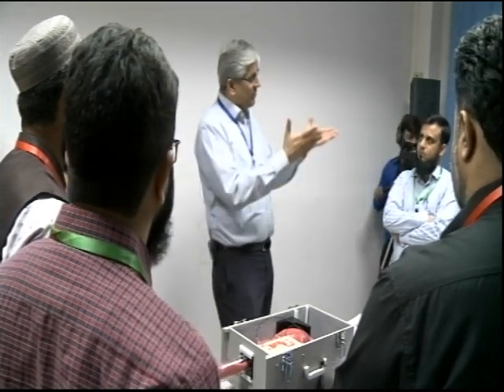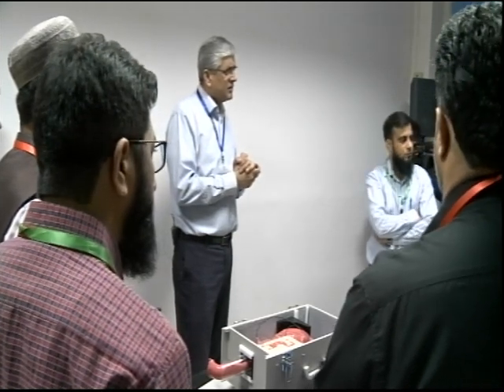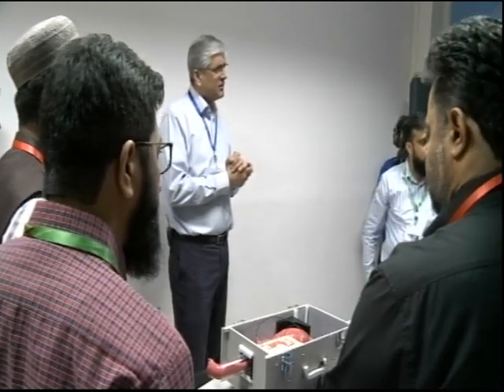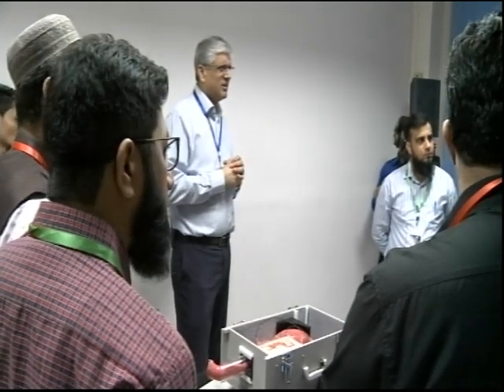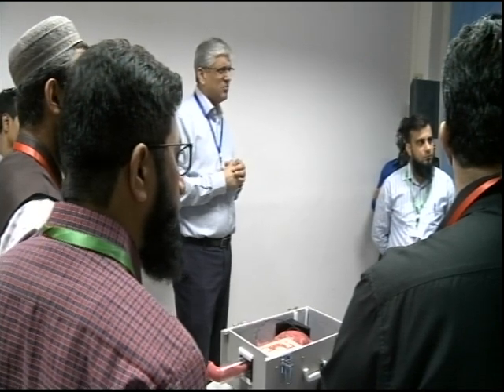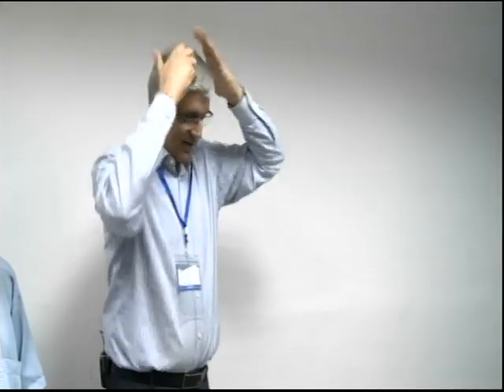Okay. That's one of the times. We have a bit of an incline, a little bump under them, so they're not completely prone. Okay, so slightly. The same with you? I do predominantly left lateral, slightly. It's kind of a semi-prone position, which is what we always did, and if you wanted prone, all you need to do is just straighten the legs, and the patient goes flat. I used to do the same thing, and we all did that, I think, in the earlier part of our work. Now our patients here are prone.